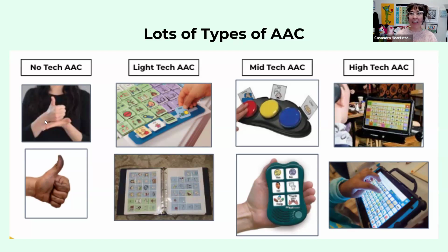Mid-tech buttons, I really love for super repetitive activities, like thinking about your students coming through the door in the morning and having a mid-tech with three options and you say, "Hey, how's your morning been?" And one of them says, "It's been great." And the other one says, "I don't want to talk about it." And the other one's like, "I'm okay." So regardless of your students' communication skills, they can participate in that very repetitive morning ritual.